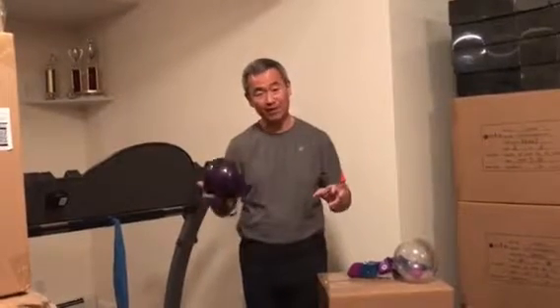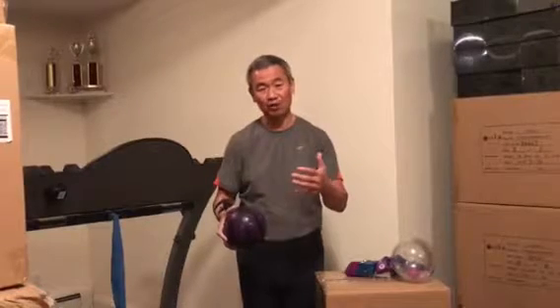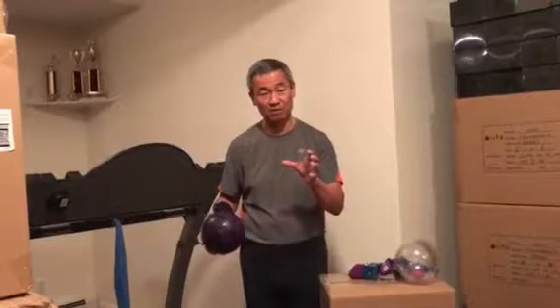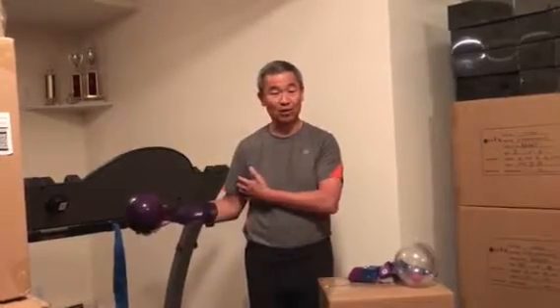If the subject bounces, then you would start again from where they left off. If you bounce at number 4, then you start from number 3 again, 5, 6, and so forth. Make sure that they do the proper exercise. And then you can see the beauty of this, you don't need to tie down to anything.